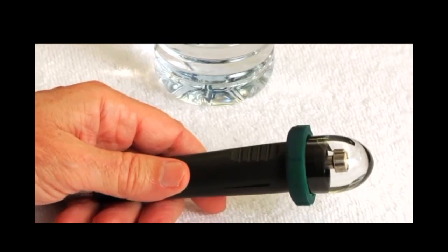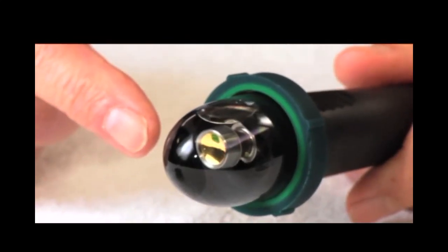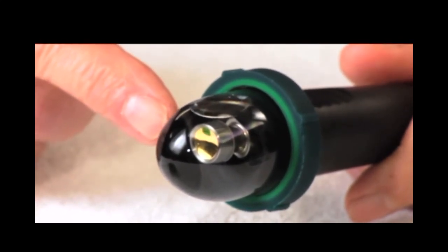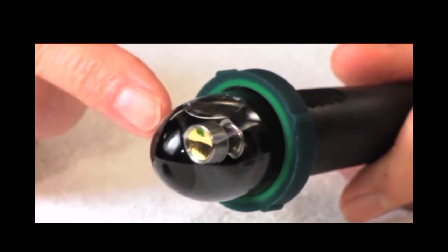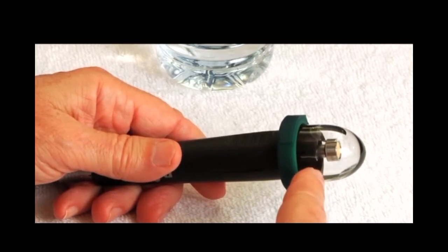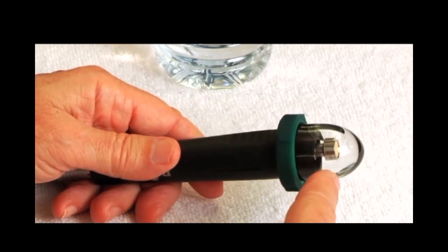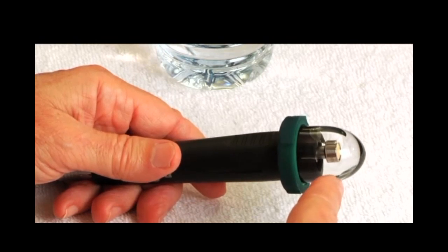What's most important is to realize that if the pressure within this ClearScan cover, within this bag itself, is higher than the pressure of the eye, several things will happen. One, you won't get complete coverage of the eye, which is important in a sulcus-to-sulcus examination. And also, you can dent the cornea. If someone has a pressure of like 2 or 3, if they have like anterior effusions or choroidals, where the pressure is low in the eye, you can push that cornea straight down to the iris. An important safety tip, don't do that.